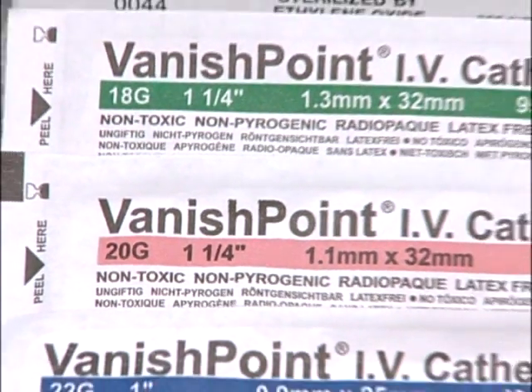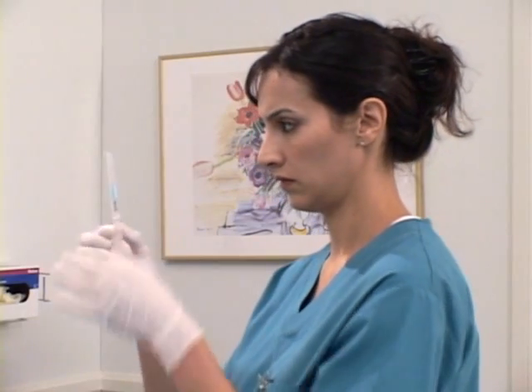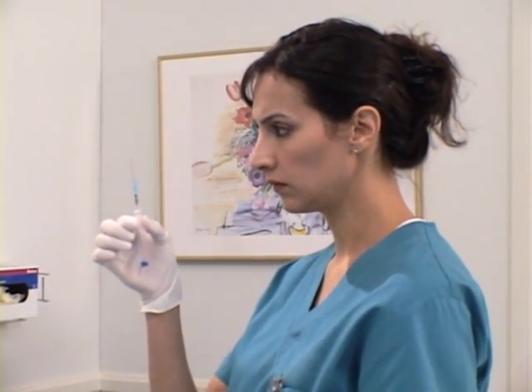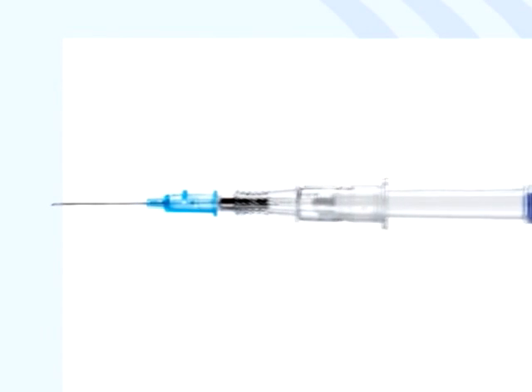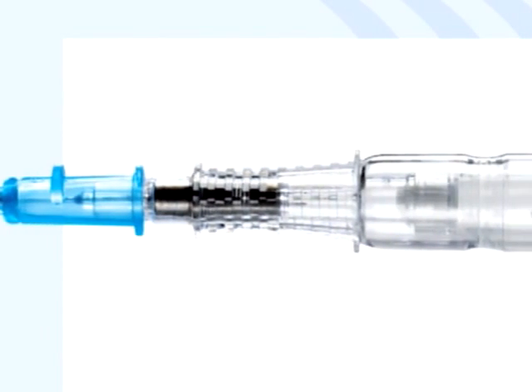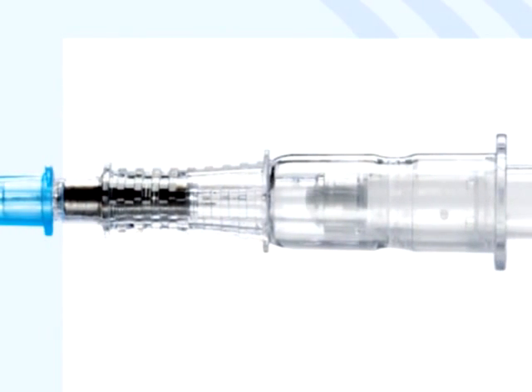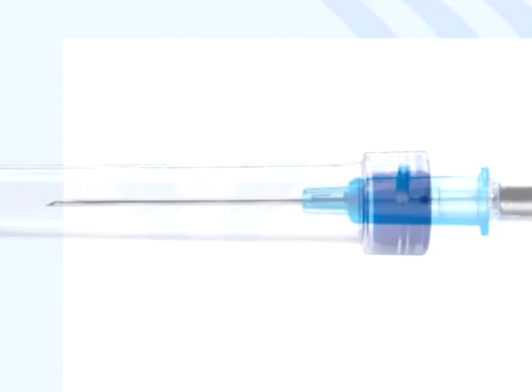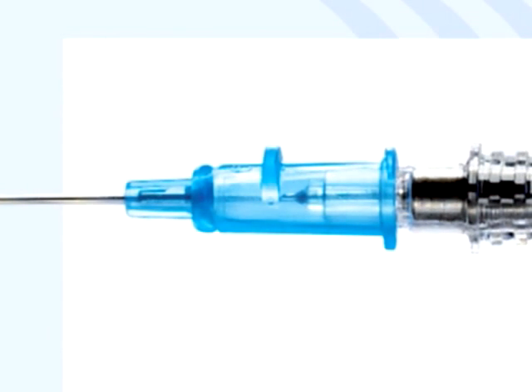Vanishpoint catheters are available in a variety of sizes, each color-coded according to international standards to indicate the catheter gauge. Unlike other IV catheters, Vanishpoint IV catheters do not require additional components such as sliding sheaths, metal clips, or activation buttons. The catheter is composed of an introducer needle and housing, which includes a retraction mechanism and finger grips for pulling back on the housing to activate the retraction. The finger grips and flashback chamber are clear to allow for flashback visualization. The end of the housing and the catheter hub are both color-coded according to international standards to indicate catheter gauge. The push-off tab facilitates one-handed hub advancement and indicates bevel orientation.